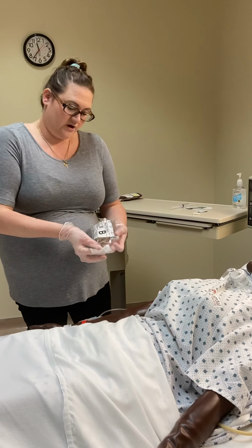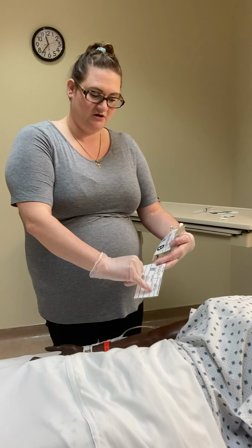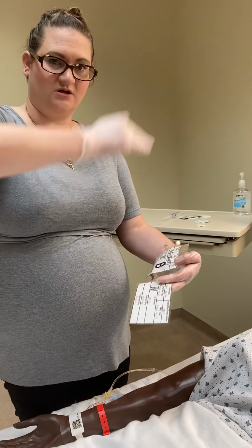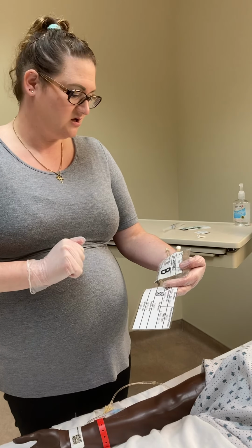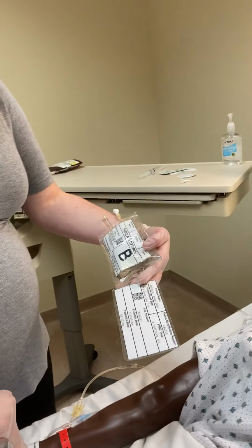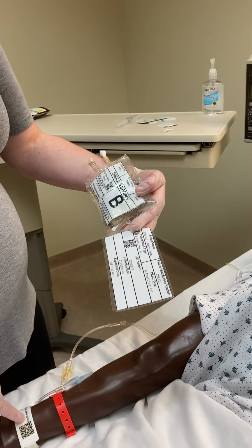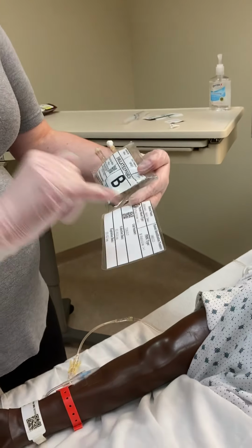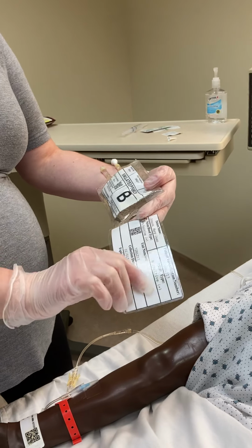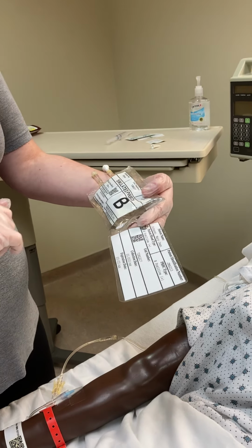So with Nurse Amy, I'm going to read off of my requisition here, make sure that it matches my bag while also looking at my screen here. So we're going to do a double check here. I'm going to make sure that it says Mary Jean Johnson and her MRN number, which is 357159. We're going to make sure that those match. She is B positive. The type of the blood is B positive, and that's correlating in the computer.